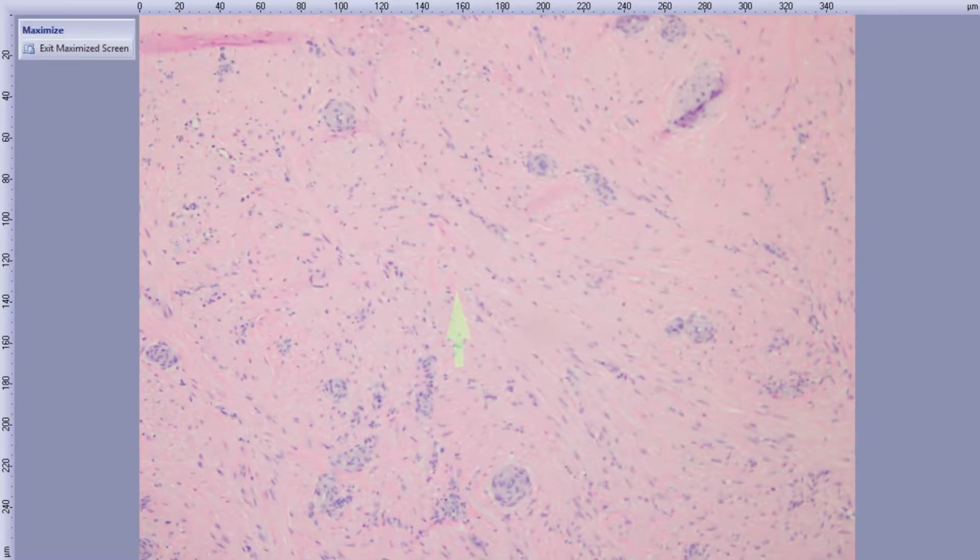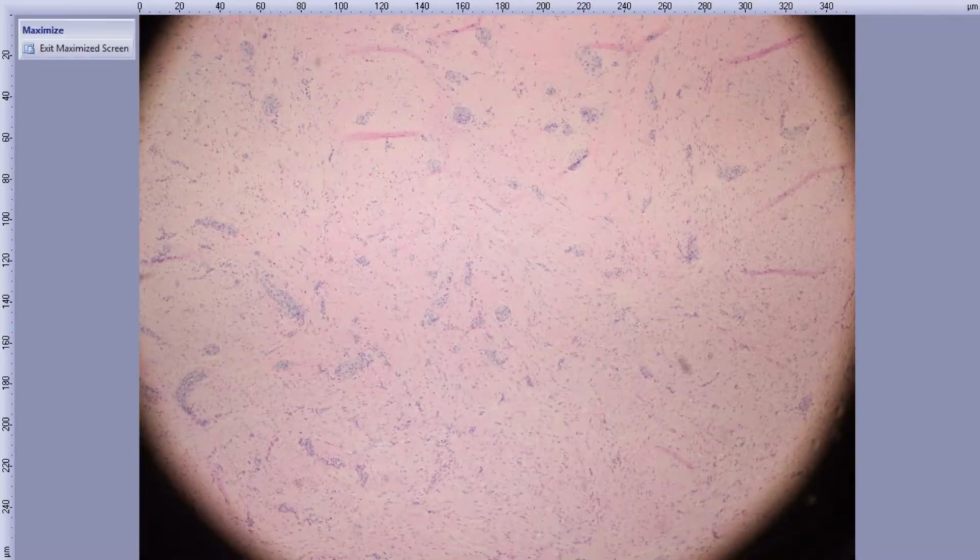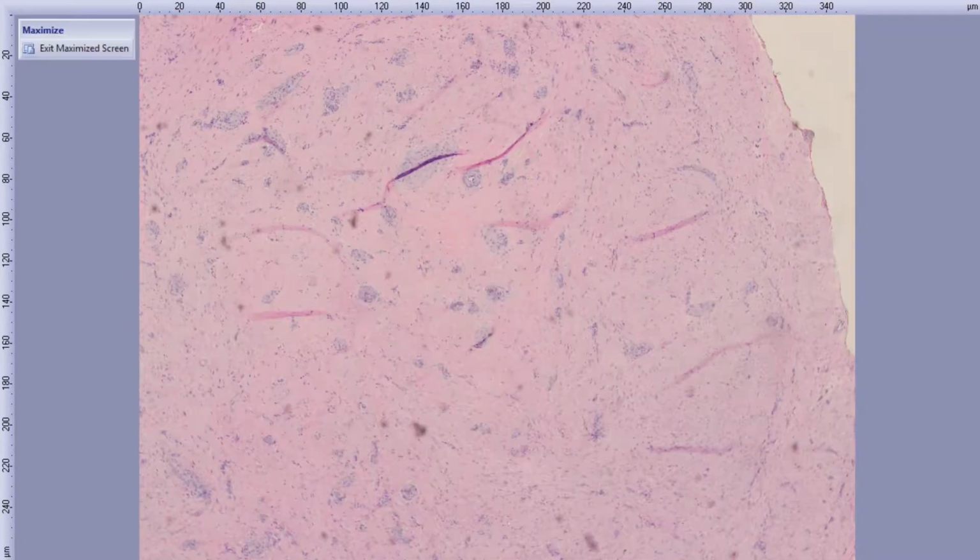All right, how about on this one? We said angioleiomyoma. Angioleiomyoma, that's right. And that's been typed in from OSU as well. So yeah, this is a nice classic example of angioleiomyoma.